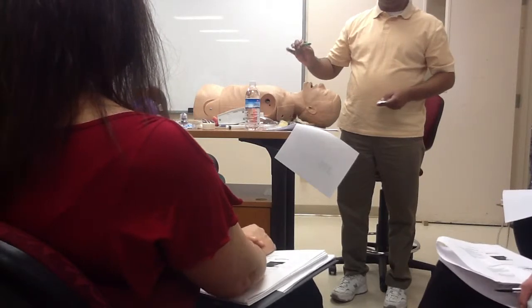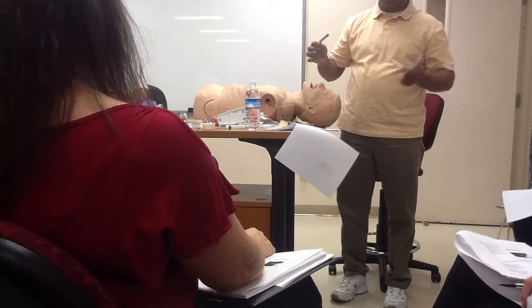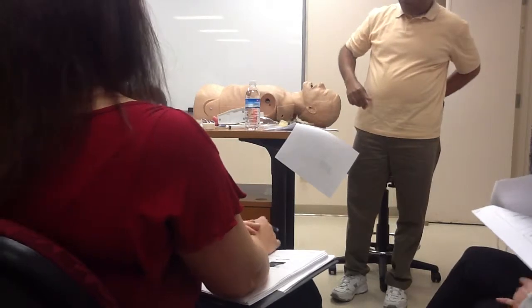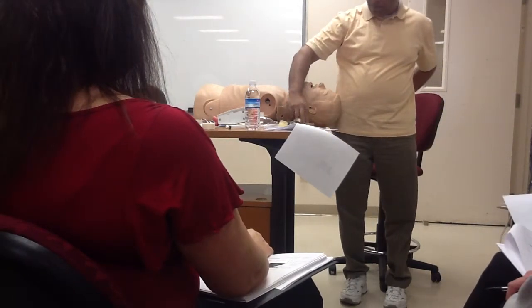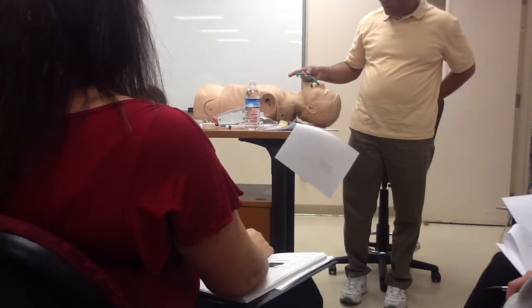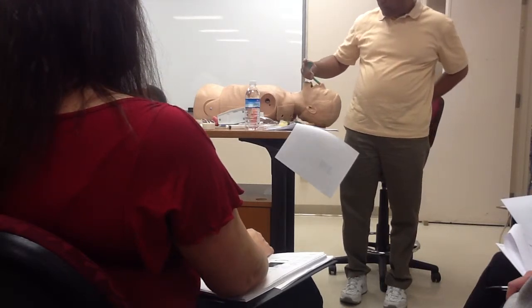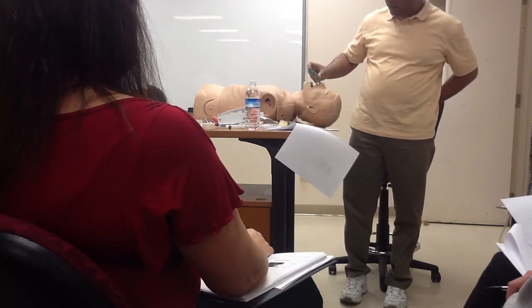Yeah. Kathy Wallace might talk about this side, but you're not really strict about it. Natural curve. How much resistance will you get? A little bit. Can we turn that to bump it inside? Let me just see. When you put it in with the tip down, it's gonna go like this. Now go on the other side and flip it. Right now, if you put that in, is that where she was talking about curving it? Yeah, she's saying that you hold it like that, and turn and stick it in like that.